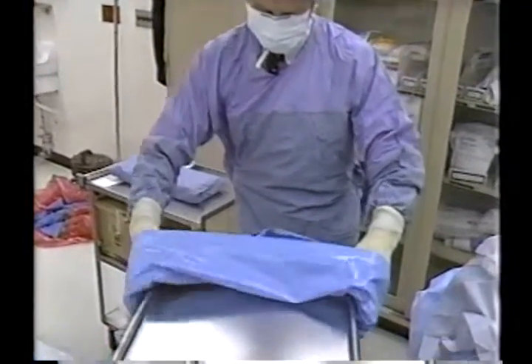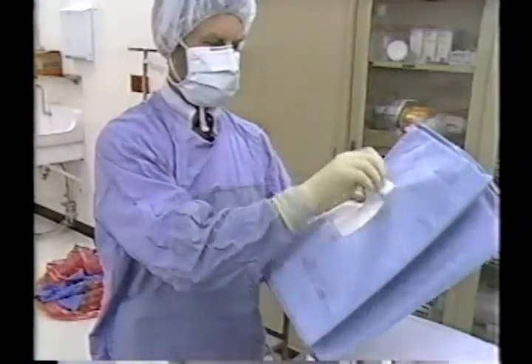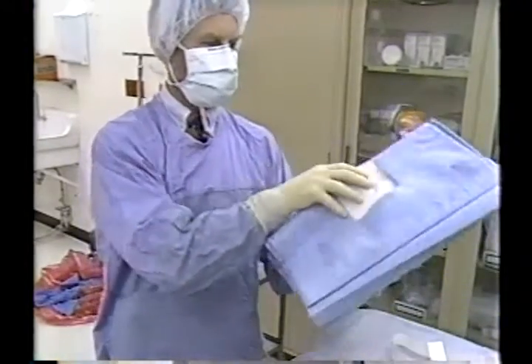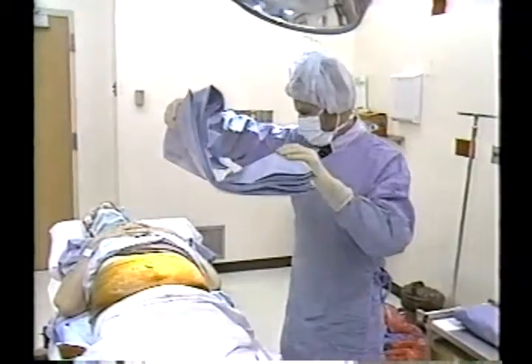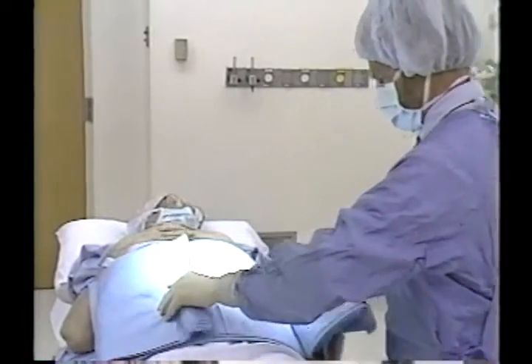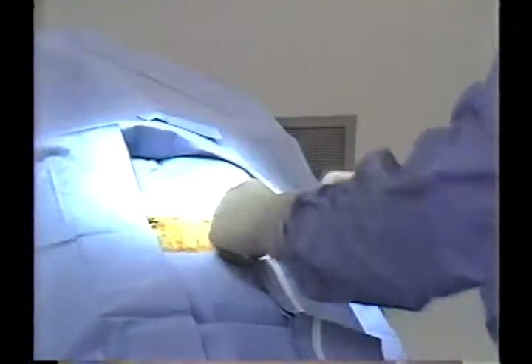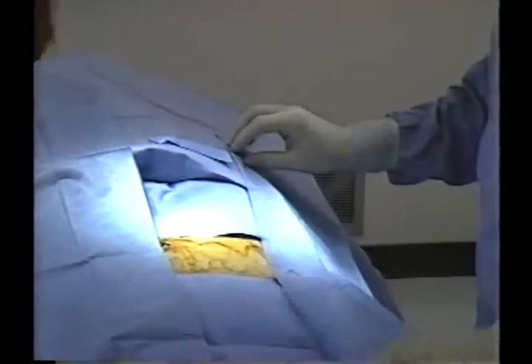The first tray contains all the preparation components. A Mayo stand cover is provided. A full-length transverse fenestrated drape is also included in the upper portion of the tray. Careful placement of the fenestration is made over the desired implant location. Two small incision drapes, also included in the upper tray, are used to narrow down the field of exposure.